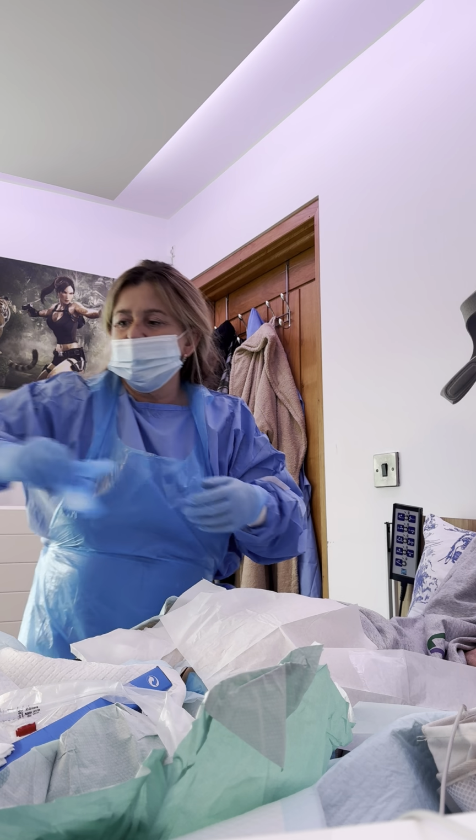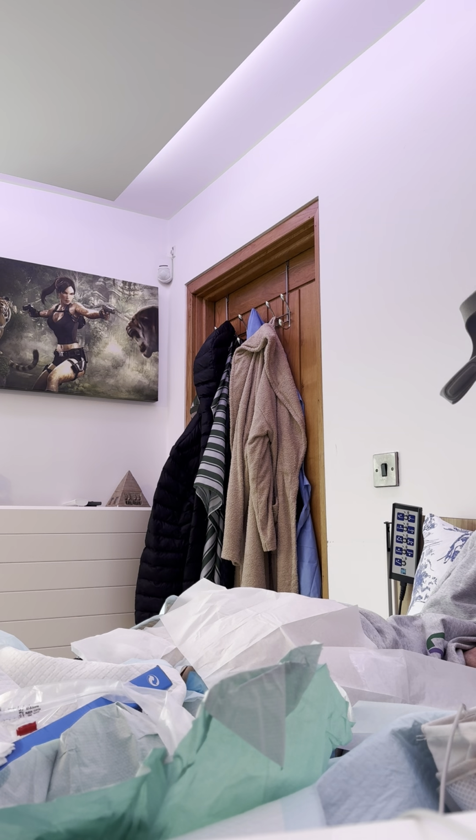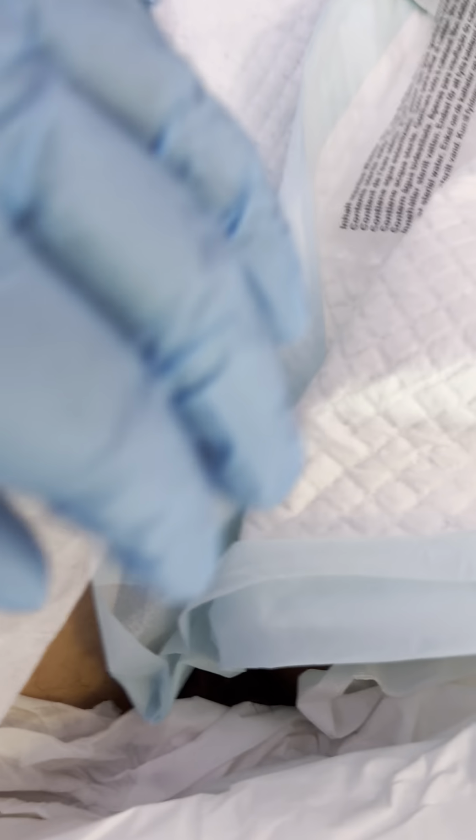So I can come and touch that camera, and I can come and show you the stoma before the new one gets reinserted. And before we do, I'll show you the mess that's on the bed that you have to deal with each time you do these. So obviously it's in here. I'm not showing anything other than the stoma, look. So it's a big grotto.